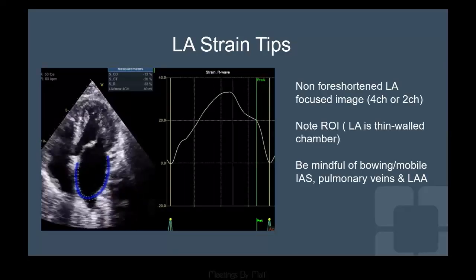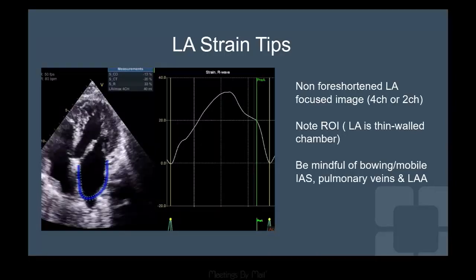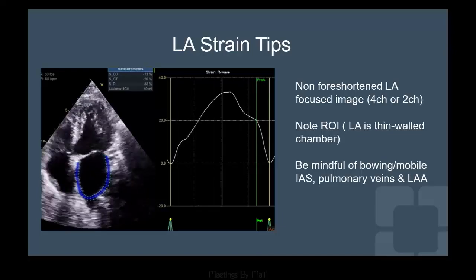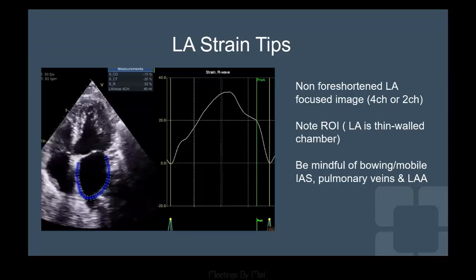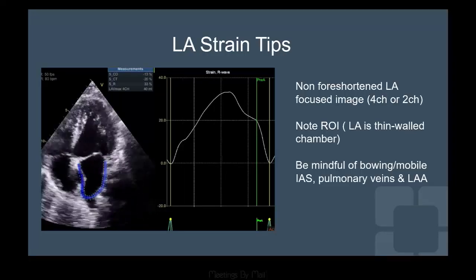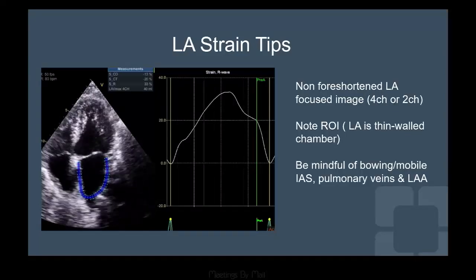But I do believe that the LV and the LA are coupled together. The mitral annular motion and the reservoir are just the mirror image of the LV. But this relationship gets decoupled with the development of diastolic dysfunction. So there is definitely a lot of information there which can help us tease out some of these patients. So it is important information. The question will be, how do we overcome the variability that sometimes comes with quality maintenance? That will be the only challenge.